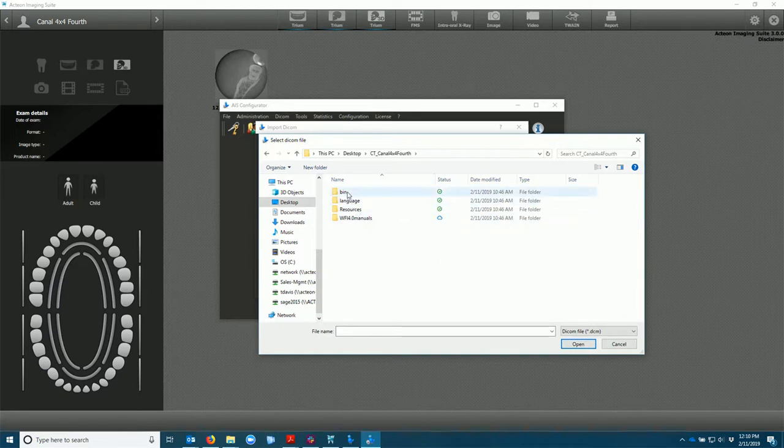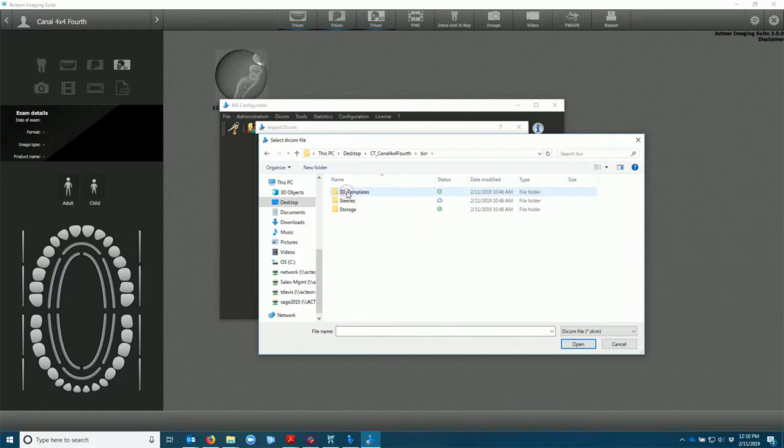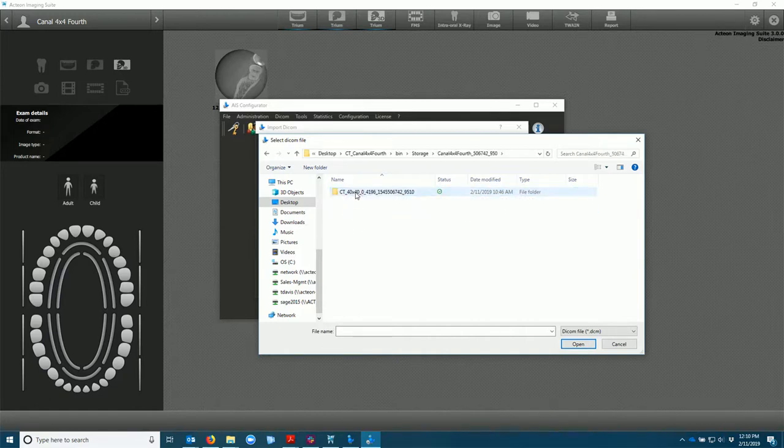You're going to go until we find the actual DICOM files. So we go to bin storage canal and the CT.